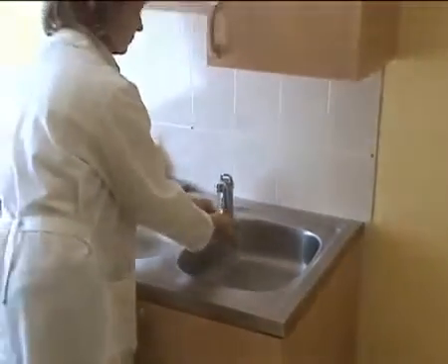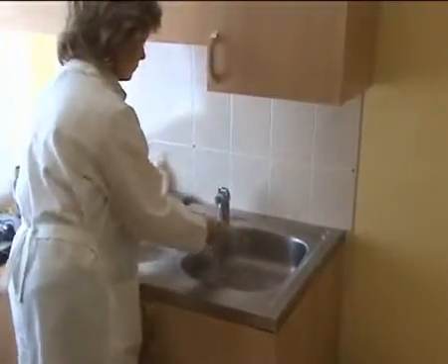To avoid the transmission of infection, always wash your hands before touching a newborn. Follow the hygiene rules prescribed in your establishment.